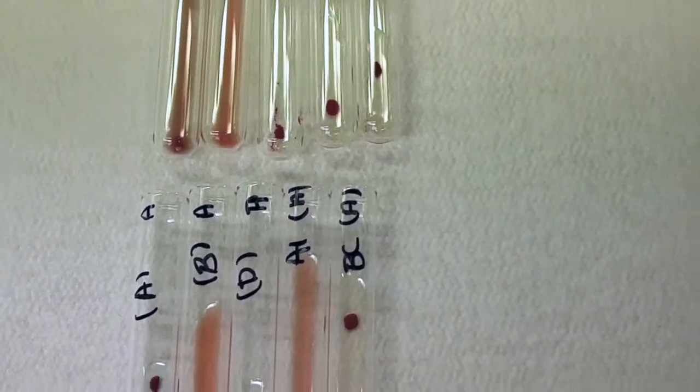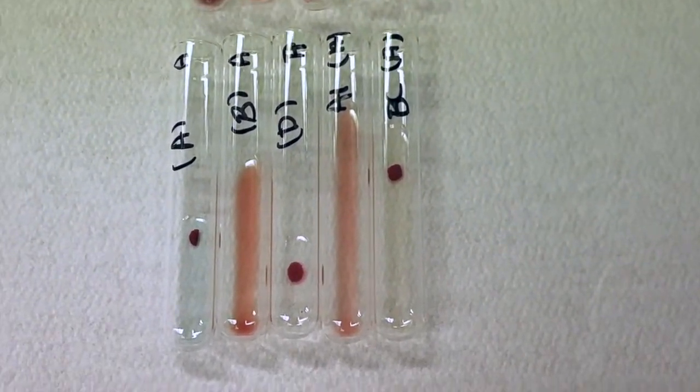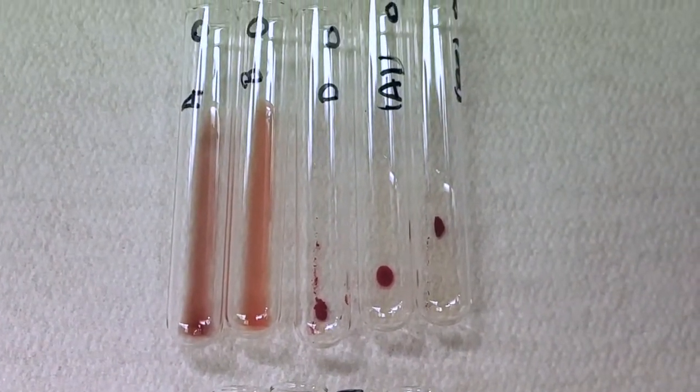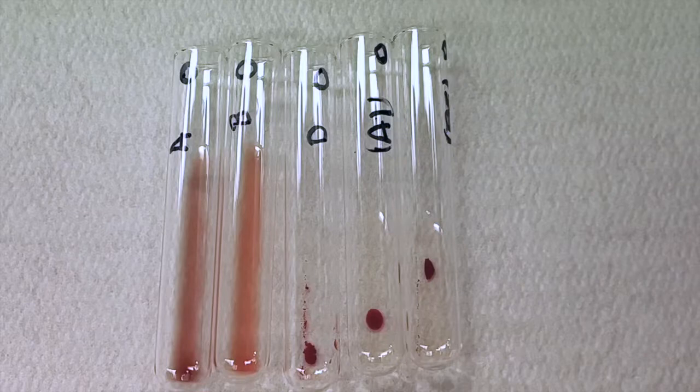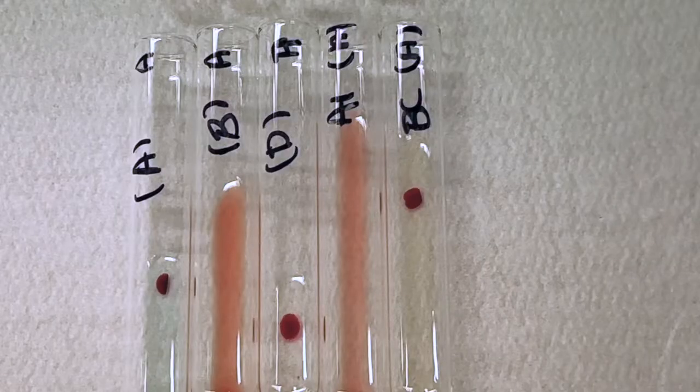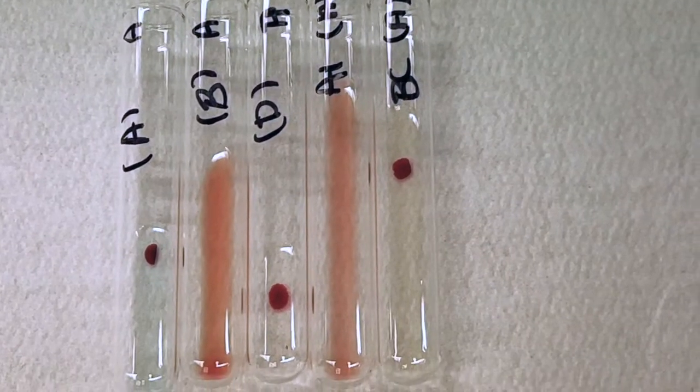So I did A and O for comparison. On the top, we know that O patients do not have the A or B antigen, and so the first tubes are negative and then the D is positive, so this is O pos. And on the bottom, we have the reverse and forward type for an A positive patient.